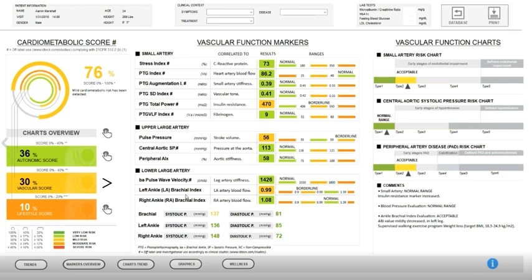So it's, again, blood pressure, and it performs the left ABI and the right ABI to evaluate for PAD. And then we have the comments that provide some guidance. Pretty self-explanatory. Again, this I will help you. If you've got questions, you need to print that out and read through that.